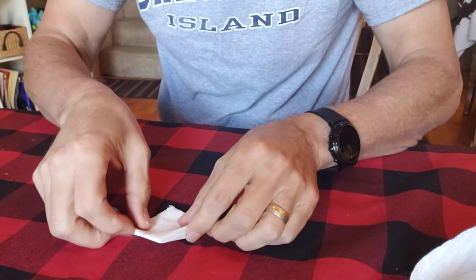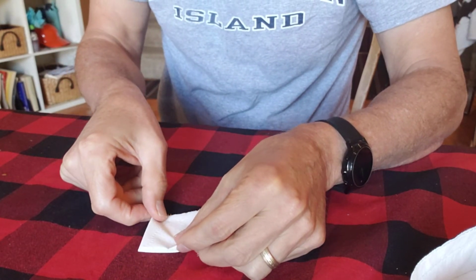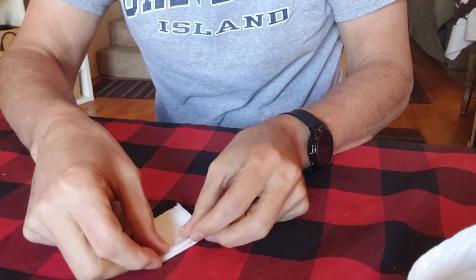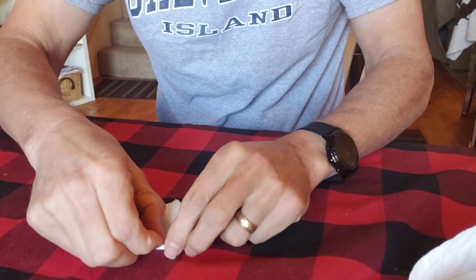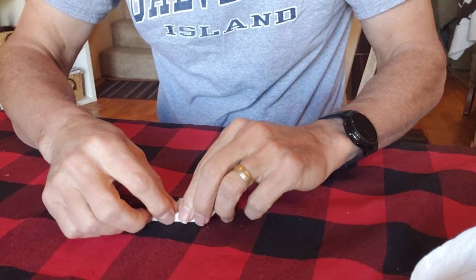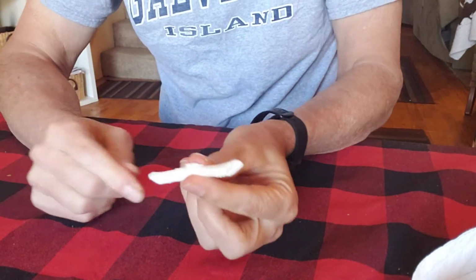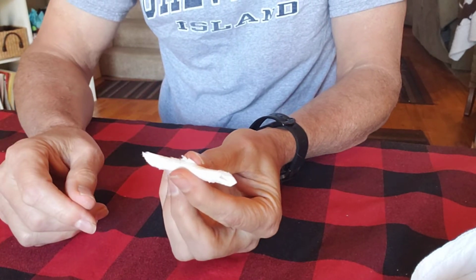And rather than folding it, I'm going to roll it up, but rather than rolling it up like a rectangle, I'm going to roll it up like a diamond. So I put a point facing me. I'll start at the point rolling. And when I finish rolling, I'll be at the point. And the advantage of that is that it's a lot thicker at the center than at the edges. And that's really what you end up needing.